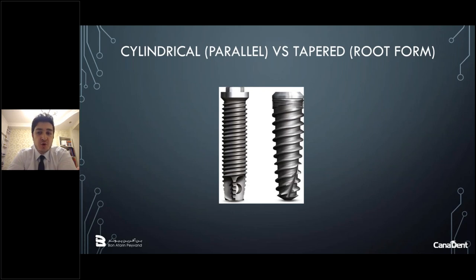They distribute occlusal forces to adjacent bone to a greater degree than parallel wall types. And the anatomic shape of this design makes perforation of the buccal and lingual bony walls less likely to occur, and creates a more favorable opportunity to safely position the implant between adjacent tooth roots. Tapered implants were found to have better primary stability than parallel-sided implants.